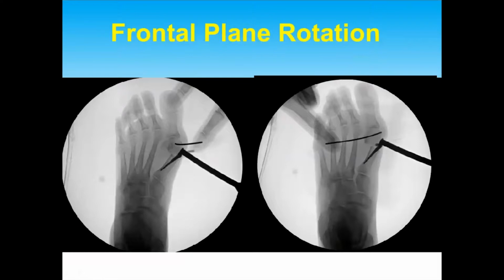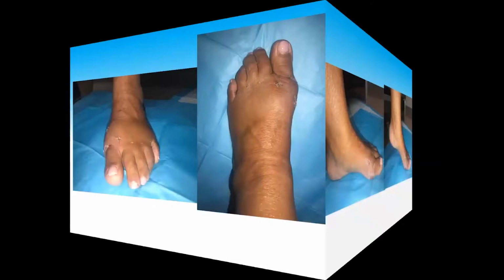Again, you can get frontal plane rotation, which is really key for this and really allows you to get those sesamoids where you want, versus the traditional chevron. And you can see some of the percutaneous incisions here, that lateral release percutaneous incision, the medial incision for the insertion. You can see that I use dissolvable sutures here, which is what you see 3 weeks post-op.